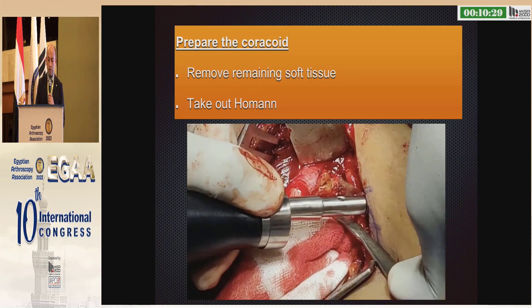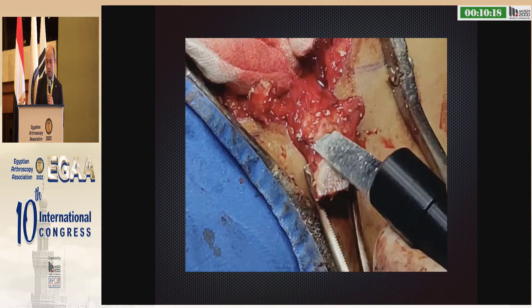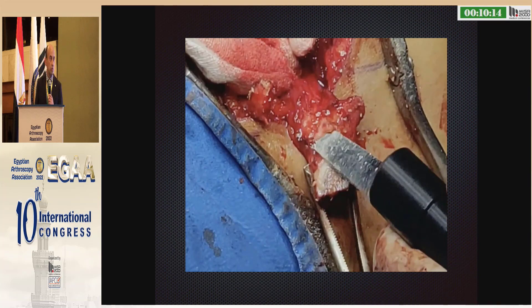To prepare the coracoid, you have to detach the pectoralis minor. After that, you will cut with an oscillating saw and remove the remaining tissue. Take out the Hohmann retractor and prepare the cortex that will be in contact with the glenoid surface, taking care with the preparation.